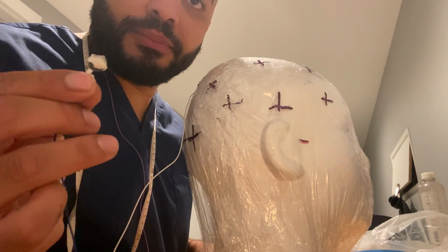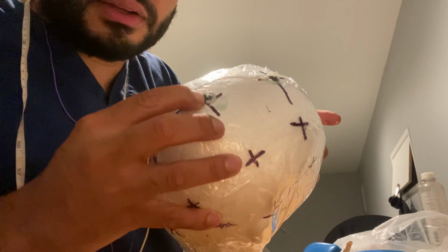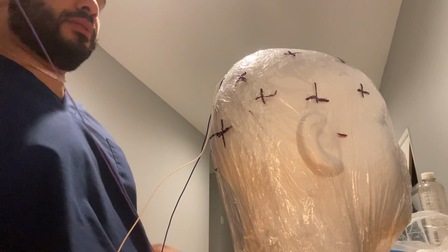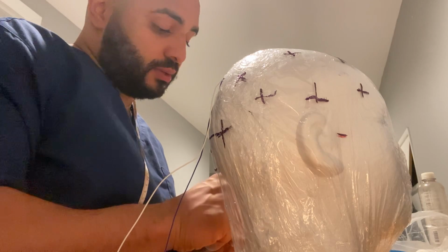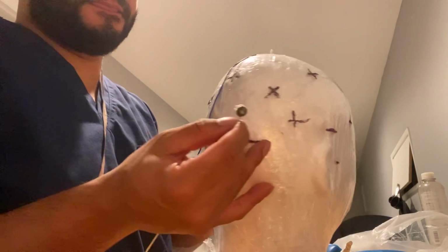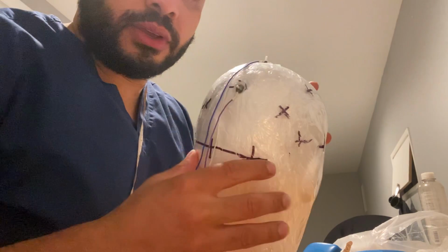Scoop of ice cream. Press down on the white. And my last one, PZ, goes into the box. Scoop of ice cream. Press down on the white. And there you have it.